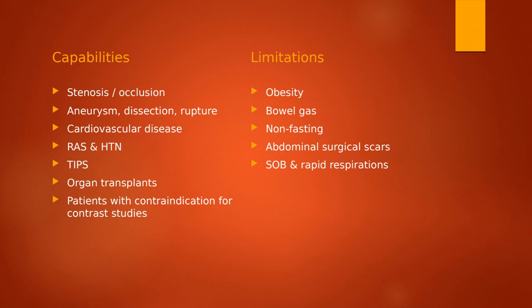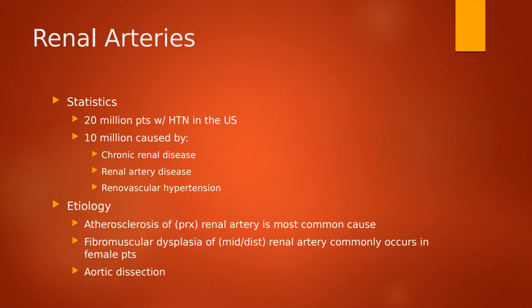And again, we're a great study for any patient who has a contraindication for having contrast with an MR or a CT exam. Limitations, of course, obesity, bowel gas if our patient isn't fasting, any kind of surgical scars on their abdomen, and if our patient cannot hold their breath. That is essential for abdominal Dopplers and renal artery stenosis exams. So if they can't hold their breath or they can't take deep breaths in, then unfortunately it's going to be a limited exam.